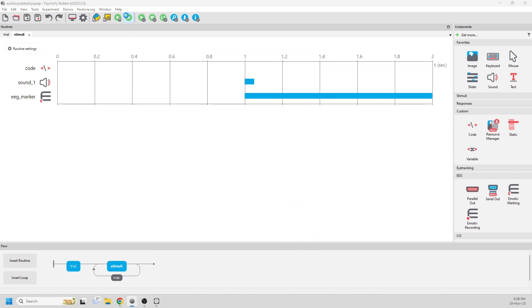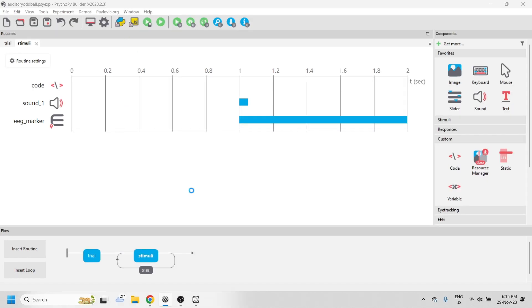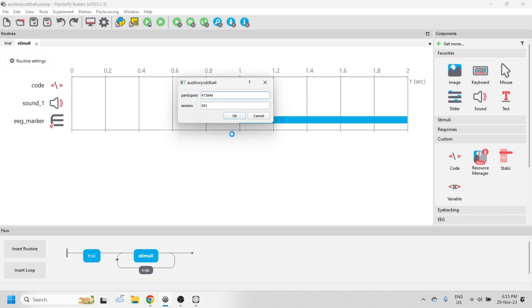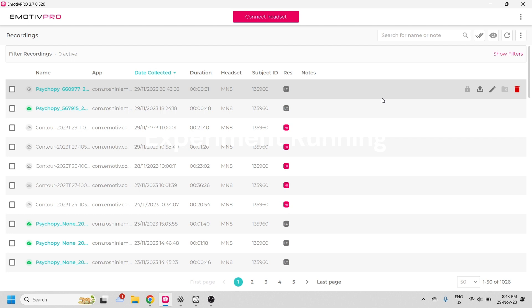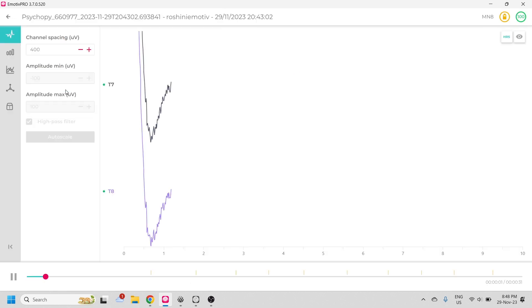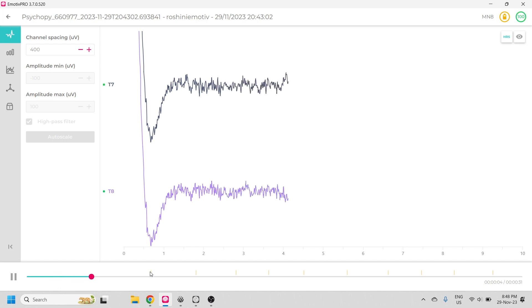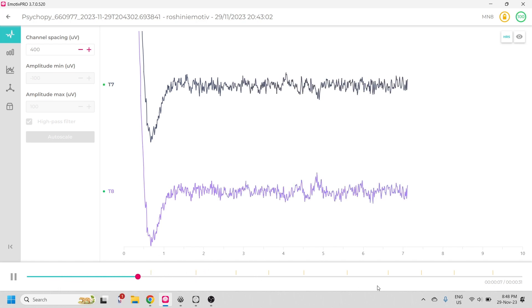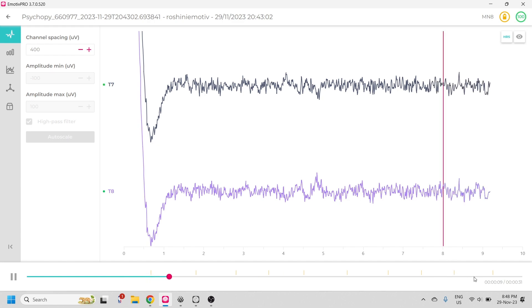Now you can run the experiment. Once the experiment is done, you'll be able to see your recording in your Emotive Pro like this. You will need an appropriate license. You can see here below that we can see there are markers and 10 of them added into our stream.